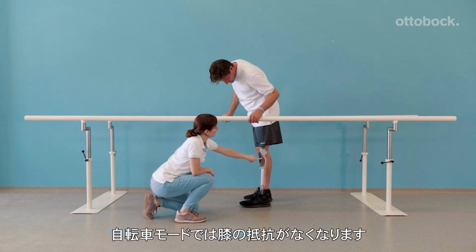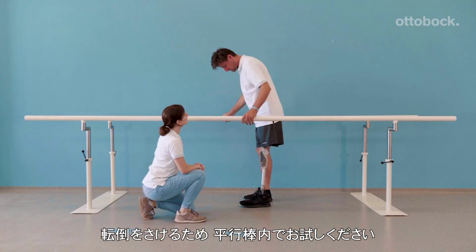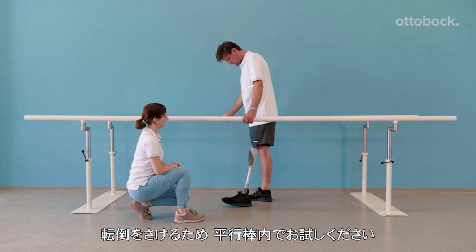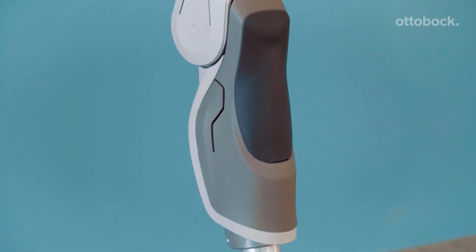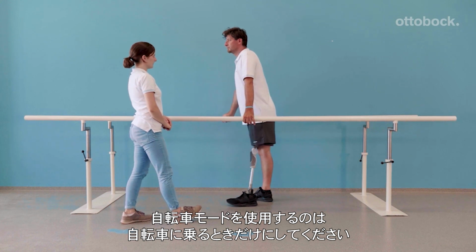To understand the free swing characteristics of the bicycle mode, try first between the parallel bars. To use the bicycle mode, activate only when you are on a bicycle and remember to deactivate before you start walking again. Remember, this is only for riding a bicycle.